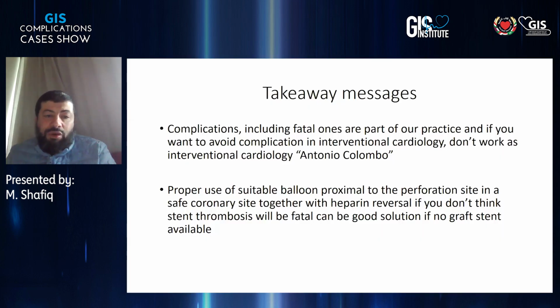Take-away messages: complications, including fatal ones, are part of our practice. If you want to avoid complications in interventional cardiology, don't work as an interventional cardiologist, as Antonio Colombo said. Proper use of a suitable balloon proximal to the perforation site in a safe coronary site, together with heparin reversal, if you don't think stent thrombosis will be fatal for the patient, can be a good solution if no graft stent is available. And thanks God, thank you.